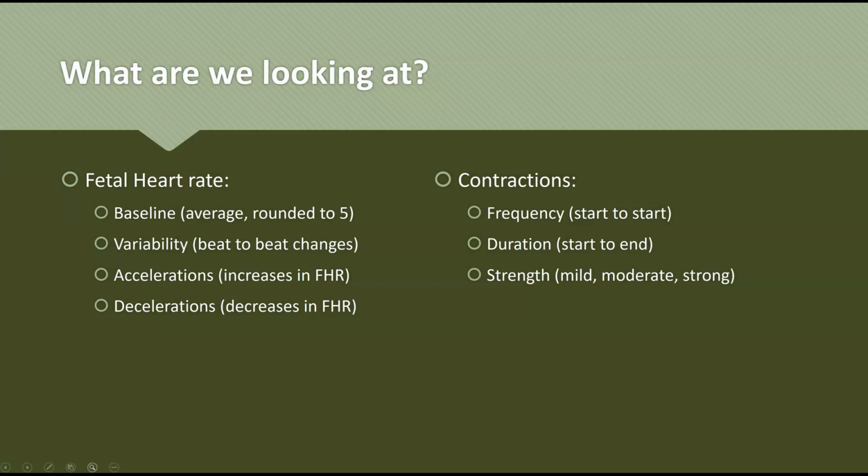You take your finger and push on your chin. So we've lost some squishy, it's more firm underneath the skin. That would be reflective of a moderate contraction. And then if you push on your forehead, the thinness of that skin and the very firmness underneath, that would be reflective of a strong contraction. Okay, so mild, moderate, or strong.